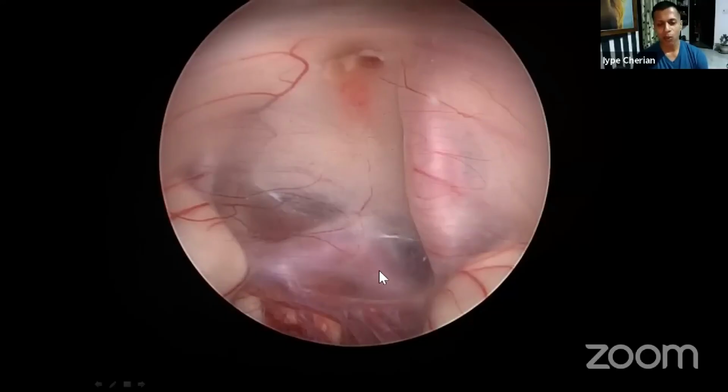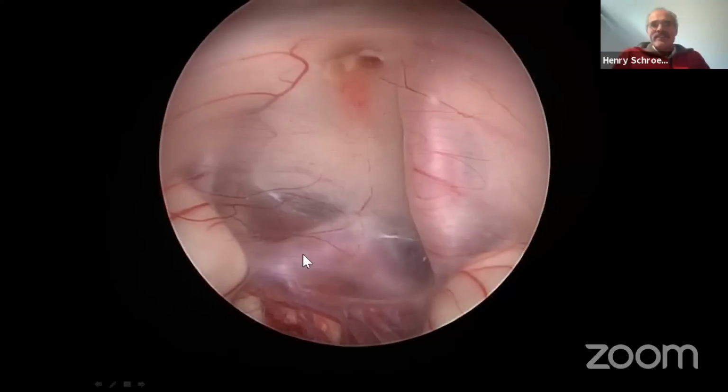Okay, so that is the A1. No, basilar tip. This is the basilar tip, mammillary bodies. This is P1, basilar tip. What is that? Infundibular recess. Exactly. And what is that? This is for the vascular guy.